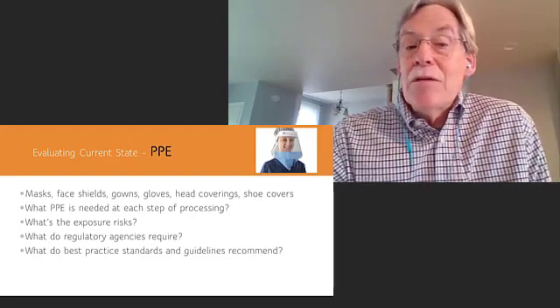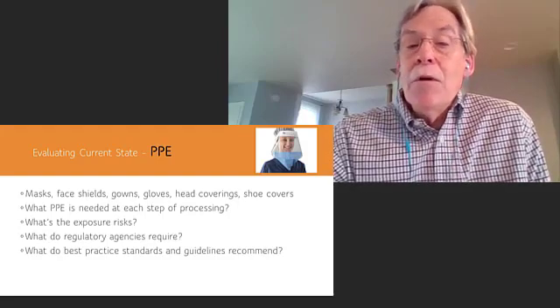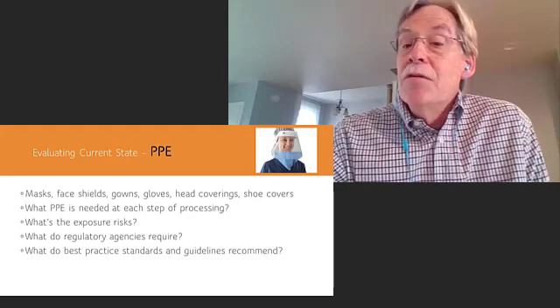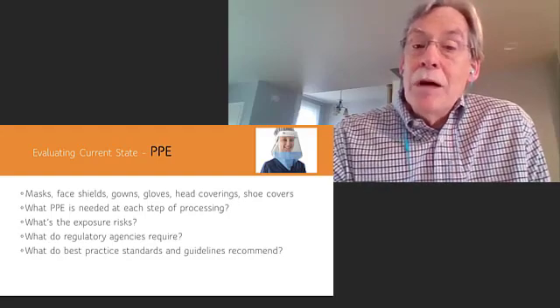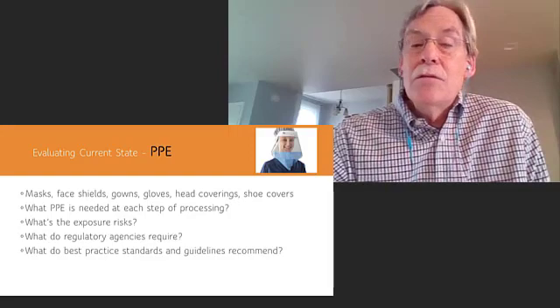we're using best practices. That includes PPE. For anyone providing patient care or processing of reusable devices, it's never been clearer that an individual's practice affects whether a patient, a family member, or ourselves are endangered. It's the established best practice that we originally learned in school and in training that'll serve us best.